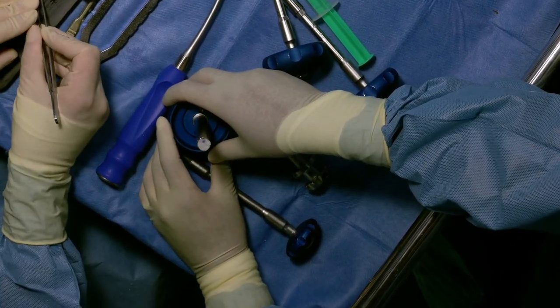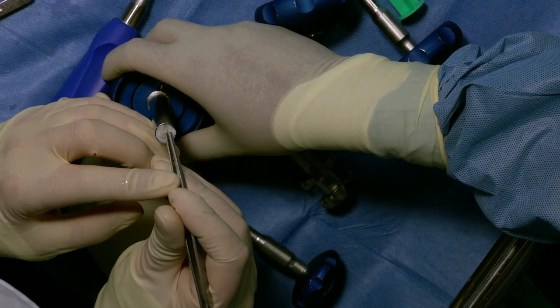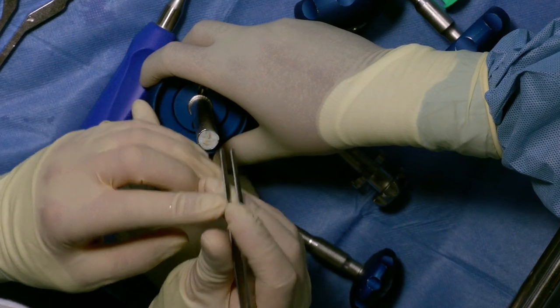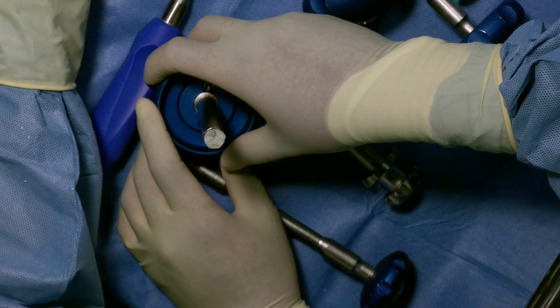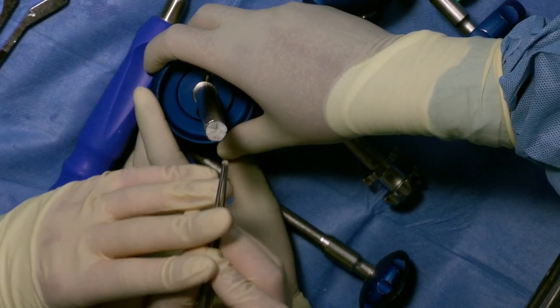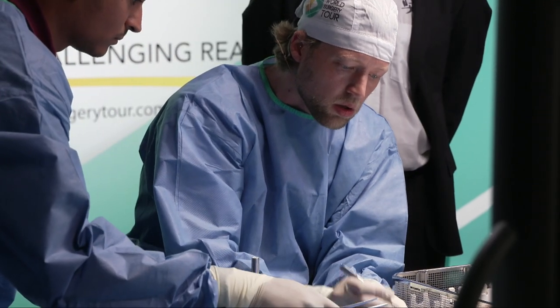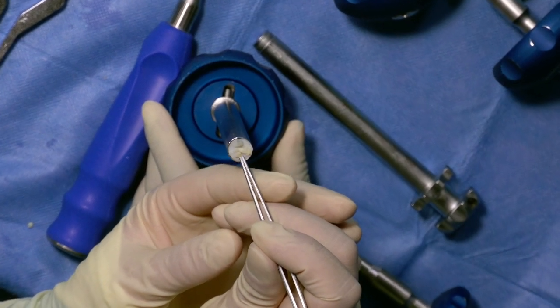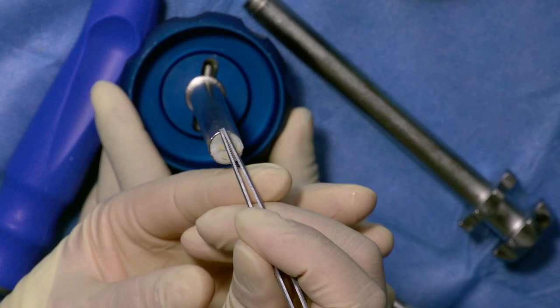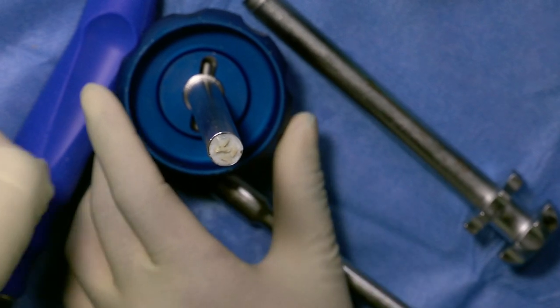So Daniel is now putting this minced cartilage, the small pieces, onto the membrane. On which side of the membrane? On the rough surface, that's important, because the cartilage should be underneath the membrane then. You want some more? Yeah, much more. How much would you like to have? So personally, I would say I like to have a thin layer that fully covers the defect size. When you do an ACI, you also don't need to apply such thick tissue. I mean, there are so many cells in there, so just have a thin layer. Again, as when we ream the defect, the height of the cartilage is typically 2 millimeters maximum if it's healthy. So don't make it too high, because it's prominent. It might be difficult to stick.